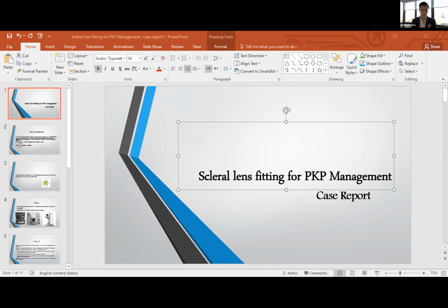Sorry, I said that in reverse. The first should go the preservative-free artificial tear, and then on top of that, place the saline, and hopefully when the patient applies the lens, they squeeze out more of the saline and leave the preservative-free artificial tear in the bottom.